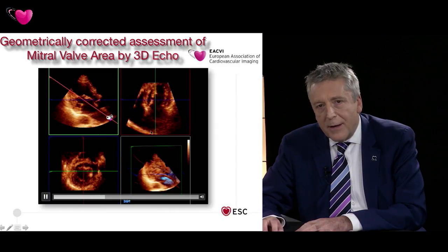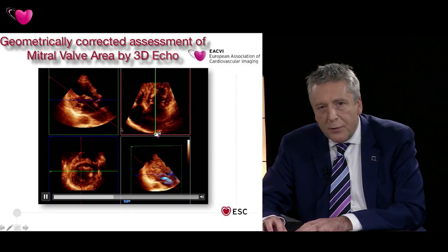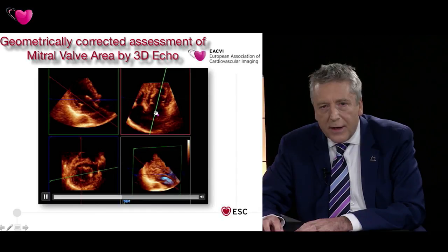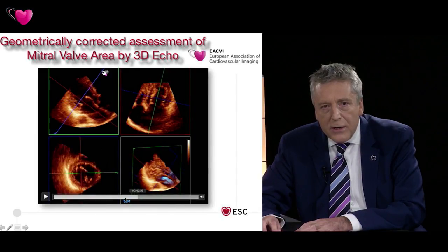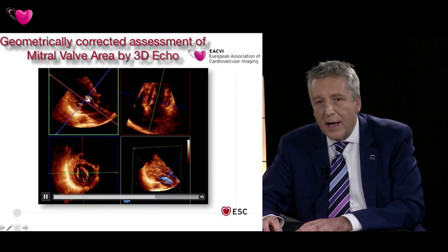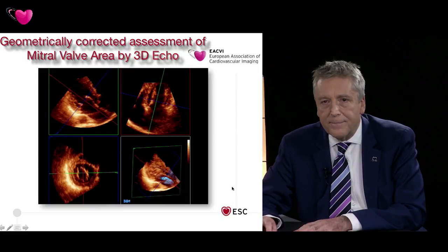In the interest of time, I'm going to advance through this, but what I'm going to do is take this blue box here and put it right across the mitral valve leaflet tips. And so you can see, if I grab this and advance it here, in the bottom left-hand side we can obtain the mitral valve area and measure that very accurately. And that's been validated in a number of different studies.